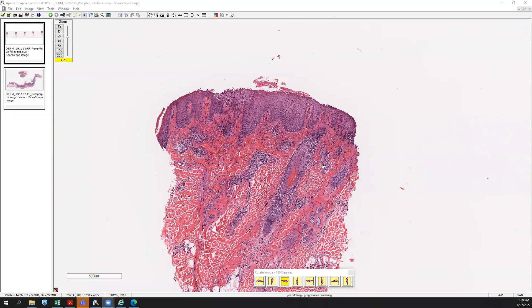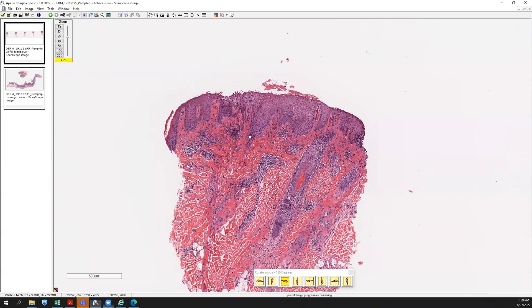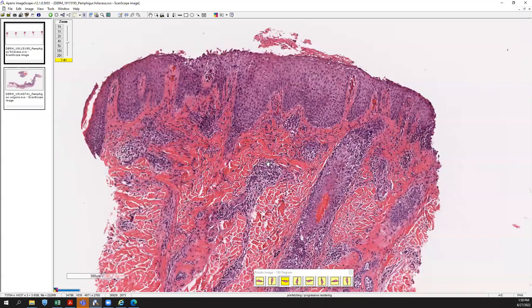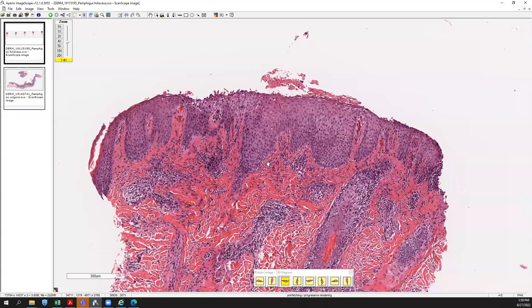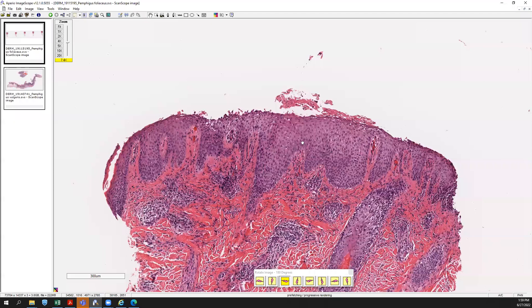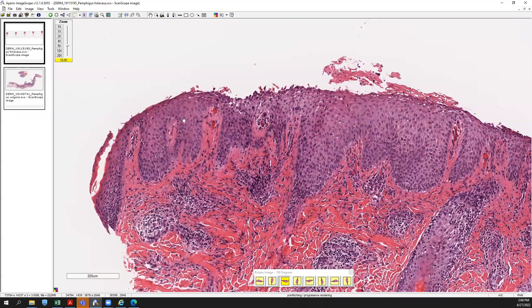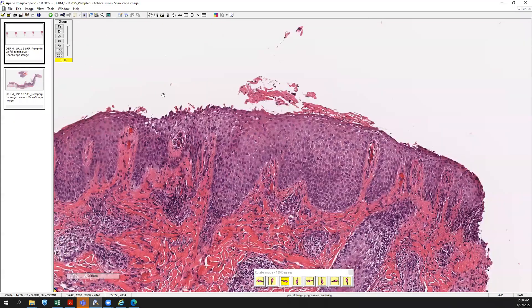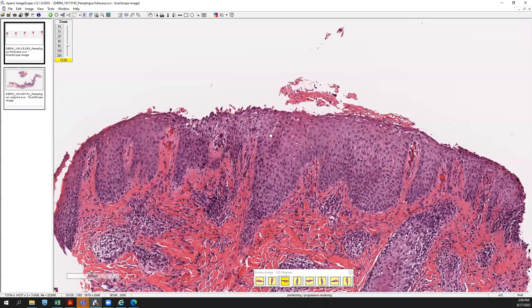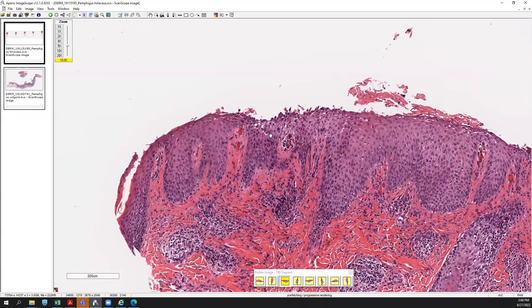Let's compare pemphigus foliaceus and pemphigus vulgaris. Histologically they're not very difficult to tell apart — you just need to remember what you're looking for. Pemphigus foliaceus is going to have a separation of the stratum corneum and the granular layer, splitting right at that point. The rest of the epidermis is pretty intact, so it's really just a superficial vesicle or bulla forming. That's why you typically don't even see intact vesicles clinically in pemphigus foliaceus.